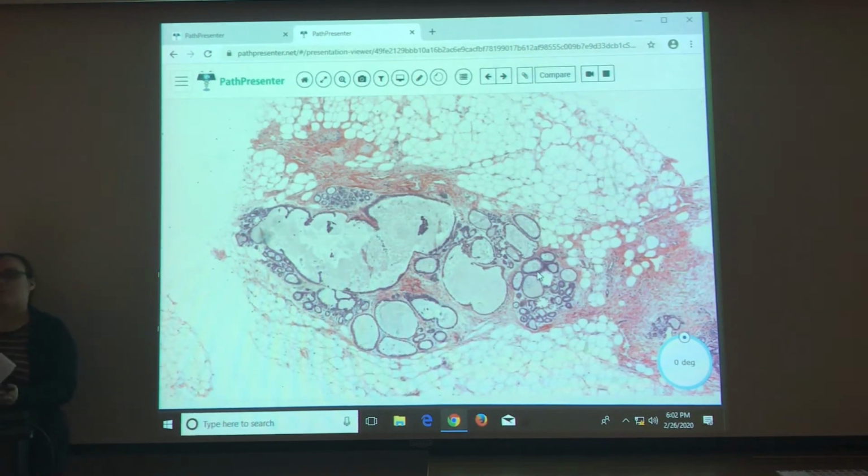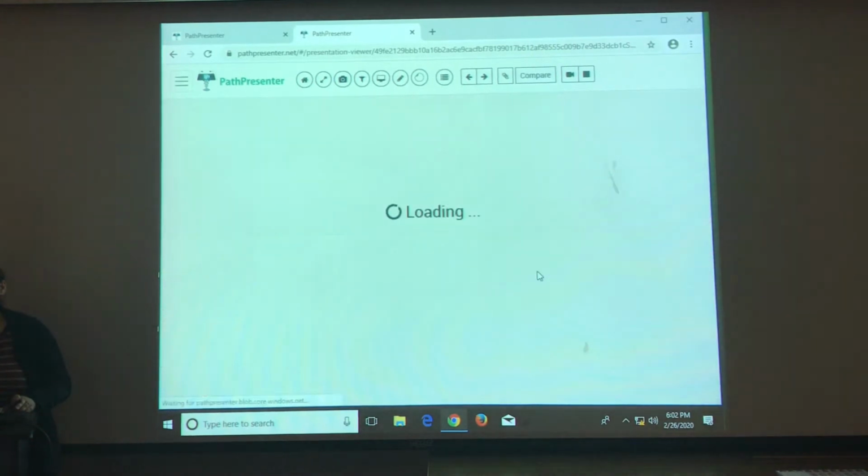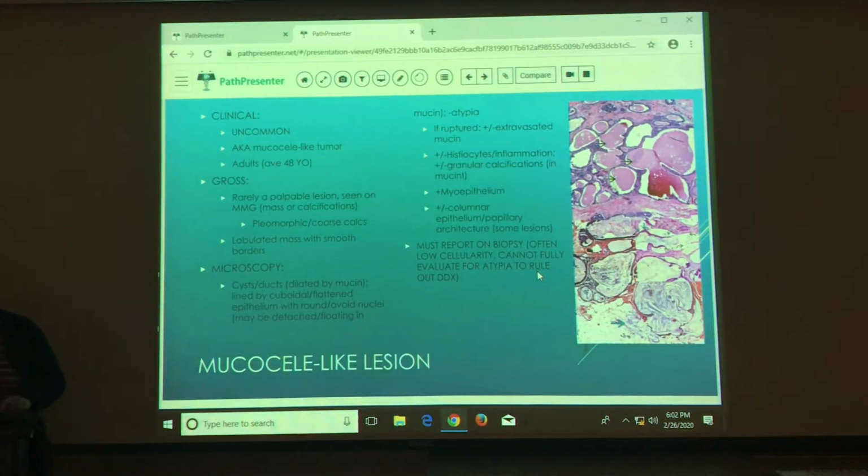And so that they go back in, they take it out, so you can actually classify the lesion. It's very uncommon, I guess. Yeah, very uncommon. These things are uncommon, so that probably means next week we'll see a few of them floating around.